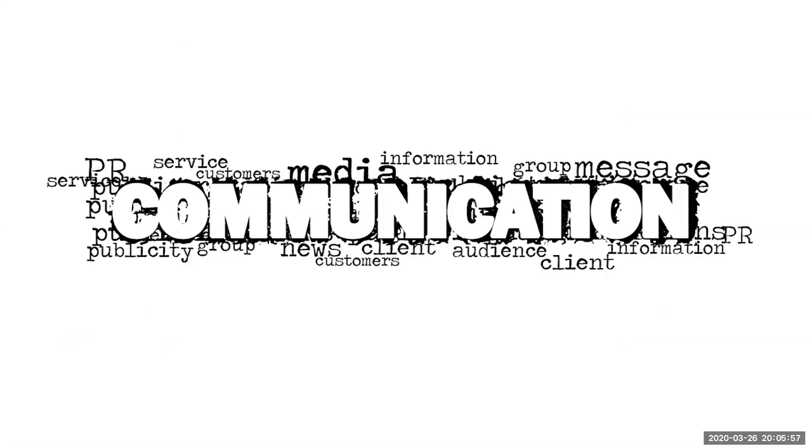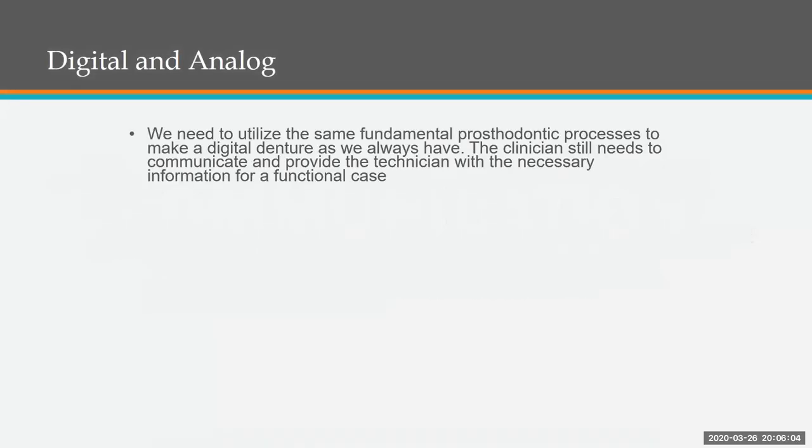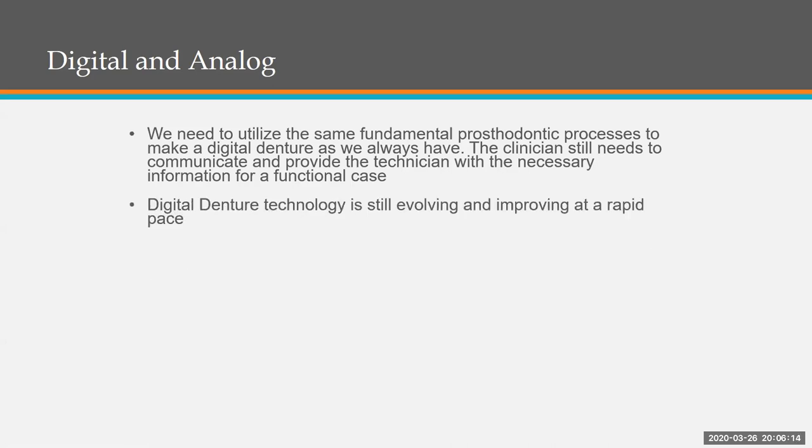And that includes communication, very important communication and planning these cases. We need to utilize the same fundamental prosthodontic processes to make a digital denture as we always have. The clinician still needs to communicate and provide the technician with the necessary information for a functional case. Digital denture technology is still evolving and improving at a rapid pace.